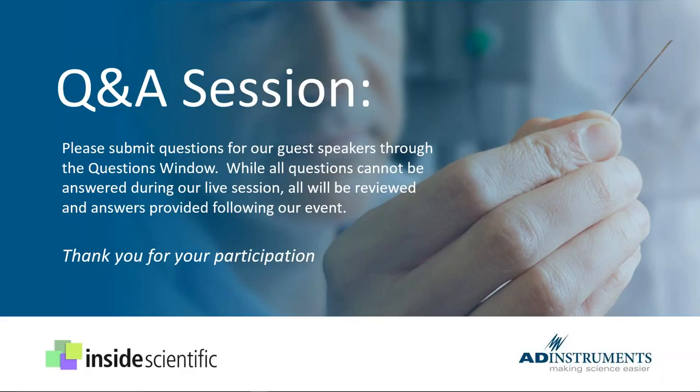So much like the ones presented. However, he finds a big challenge in selecting specific waveforms for the parallel volume adjustment, so basically working within the software. The variability, depending on which waveforms you select, so this is his experience, can be quite large. So, Jim, how do you approach looking at a saline wash and making those selections so it's consistent and in your eyes accurate from animal to animal?